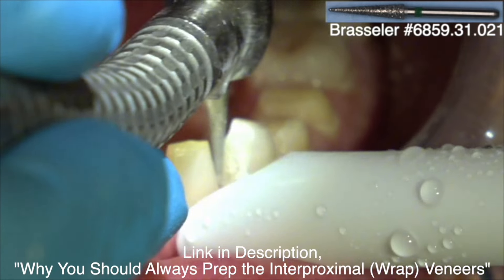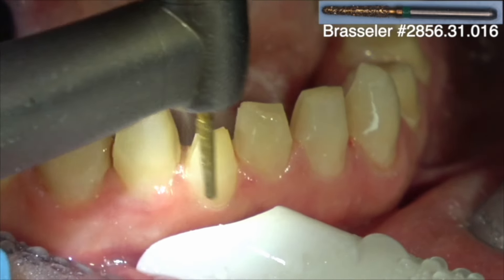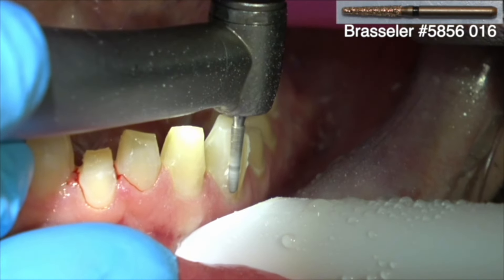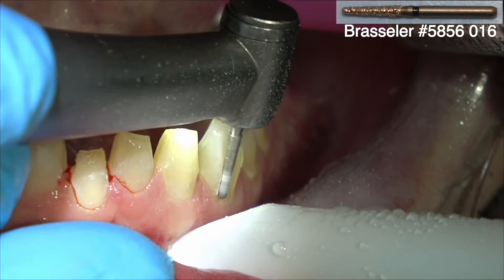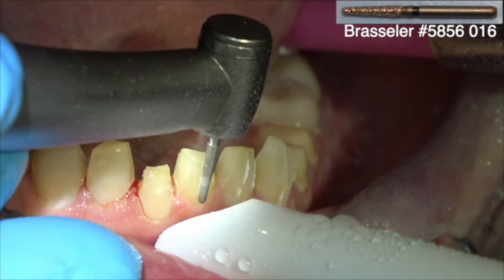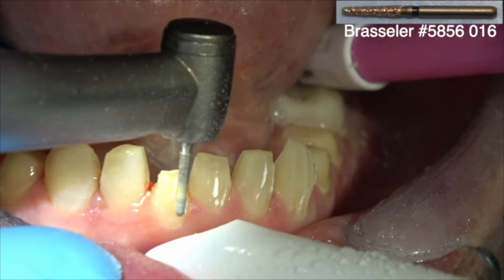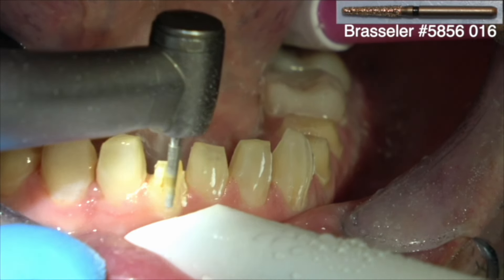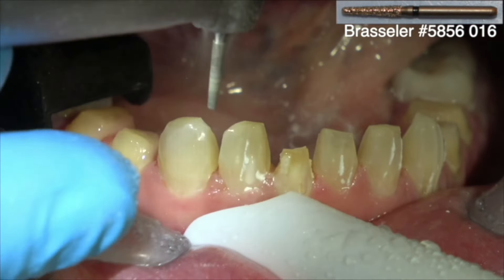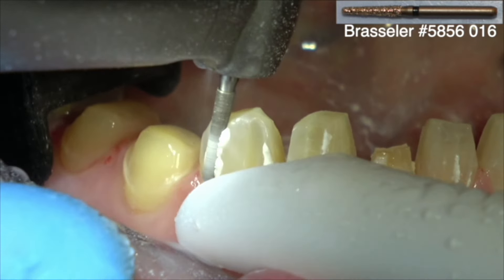I want to first cut the teeth back into the correct arch alignment, then prepare the tooth for a veneer. You remove the half millimeter or so of facial tooth structure to make room for the veneer. So I'm looking at the teeth from the incisal with either the fat or skinny mirror, seeing how much tooth structure has to be removed to move the tooth back into the arch alignment. I do that first, then remove another half millimeter of tooth structure for the veneer preparation.